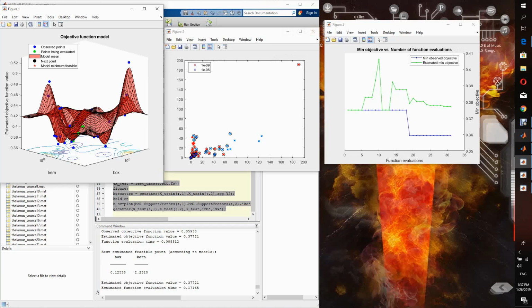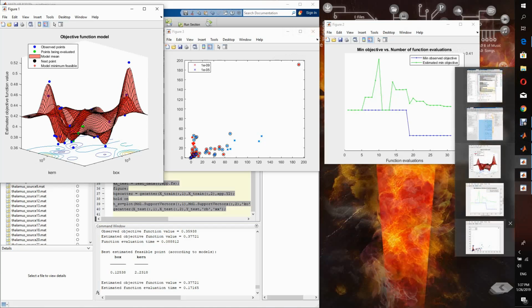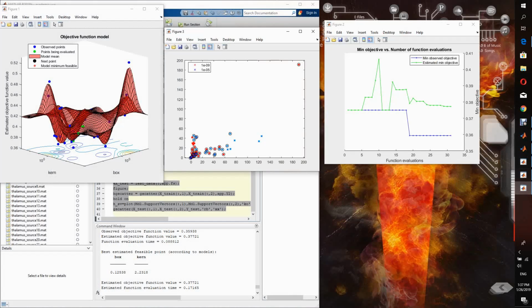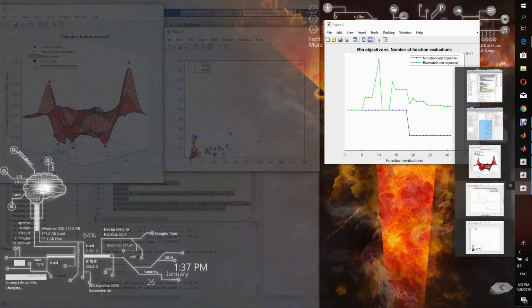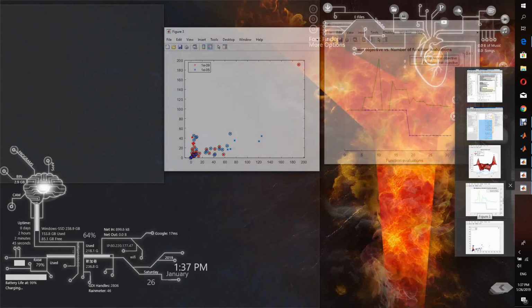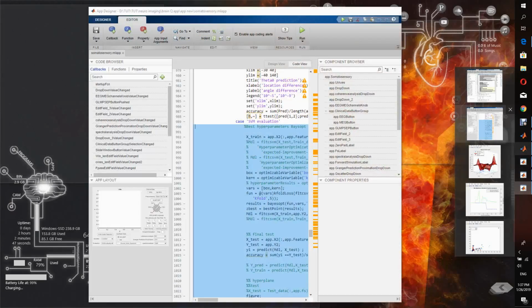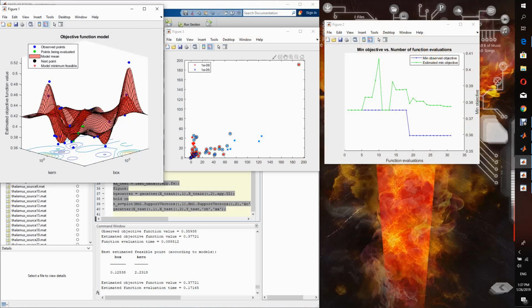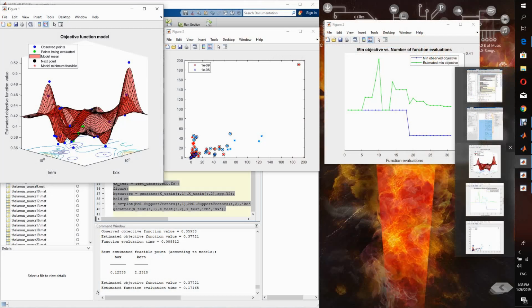I am also trying to map the features onto the head model using the non-negative matrix method, which I can also have some results on later. Thank you.